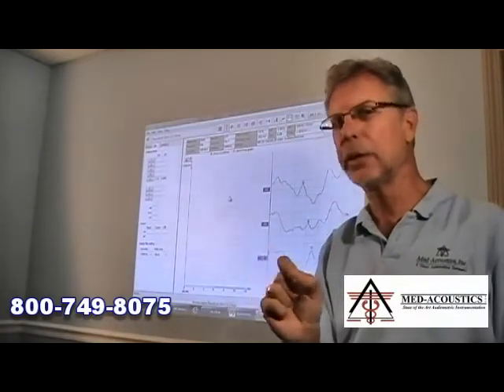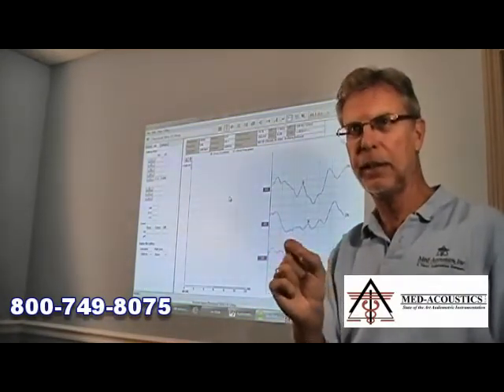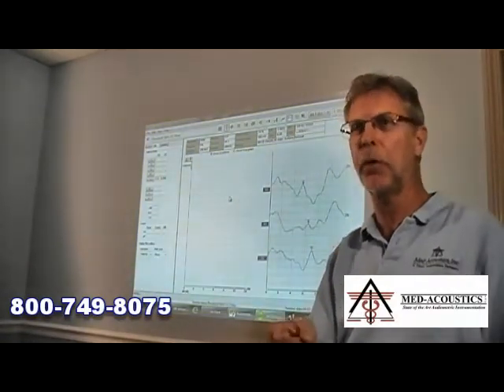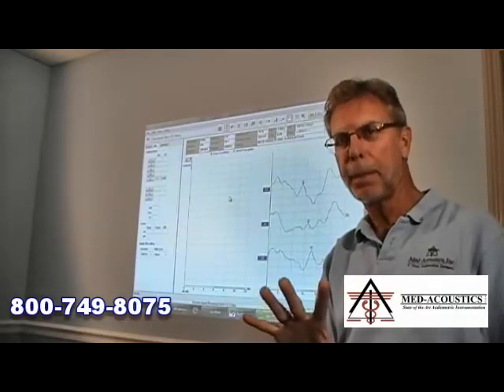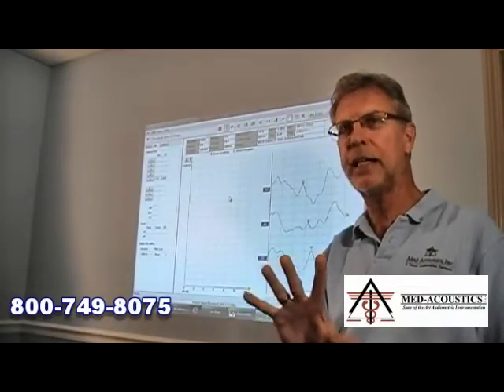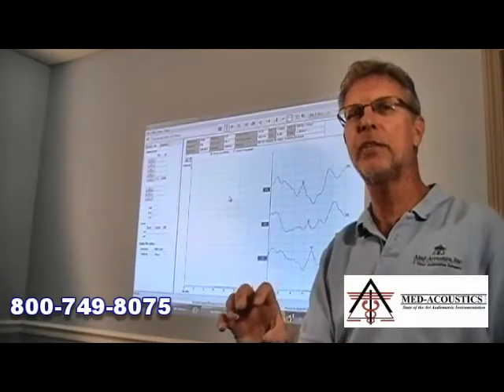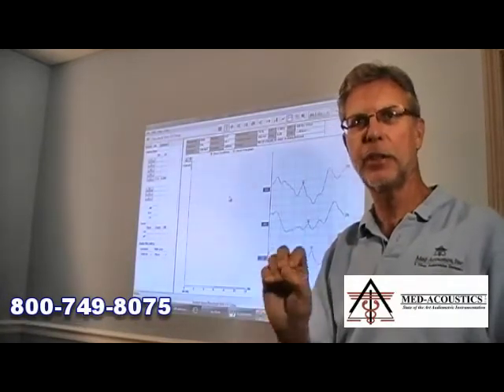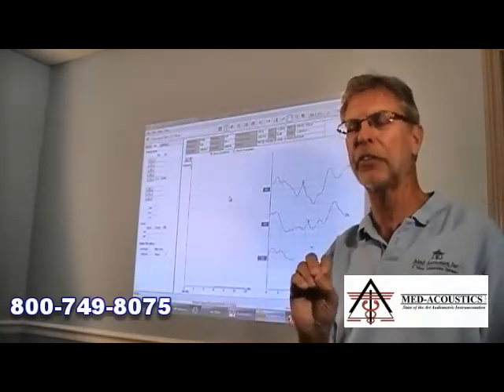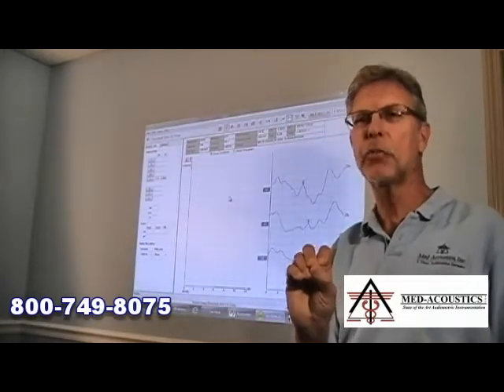Well, without going into all the details of how that's done, the bottom line is, when you do that, as well as the AP-SP ratio, the system does it practically automatically. You do have to mark 2 other points, so you're marking 4 points instead of 3 points. But the point is that it increases the sensitivity of this test. The sensitivity of the ECOG test to actually finding cases of endolymphatic hydrops, Meniere's, is relatively low.